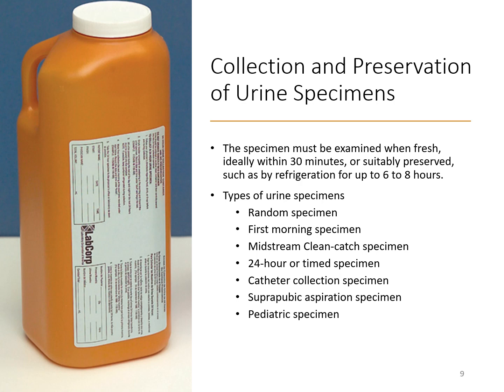Midstream clean catch. Of course, you would clean first and then start the urine, and then midstream you would catch the urine. So you would catch it shortly after you start, but before you finish.